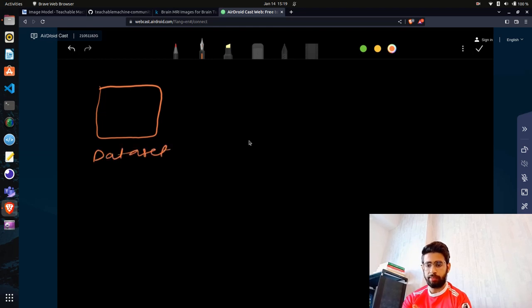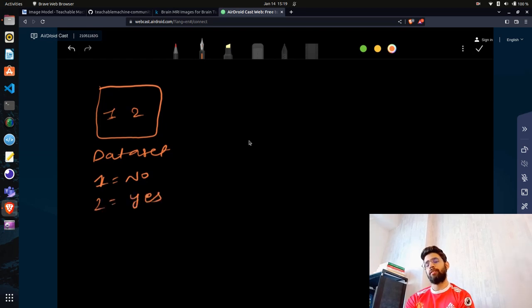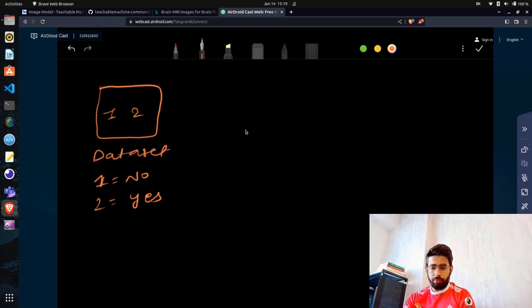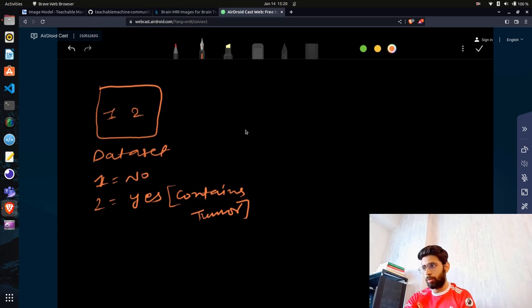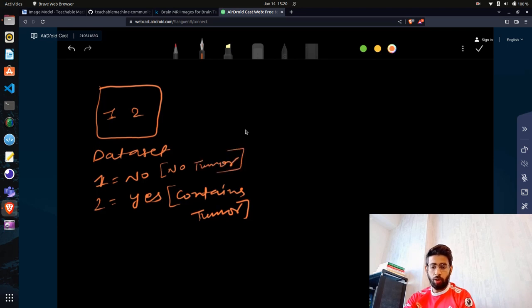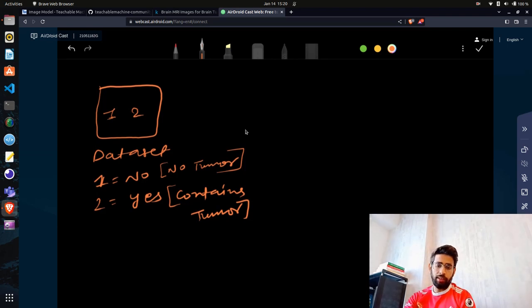We'll have two classes: Class 1 will be 'No' and Class 2 will be 'Yes,' using the data we downloaded from Kaggle. 'Yes' means the image contains a tumor or some kind of anomaly, and 'No' means no tumor was detected or found inside the image.